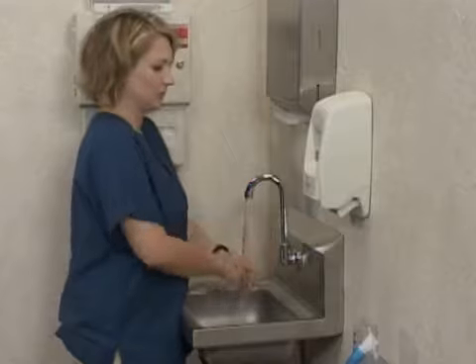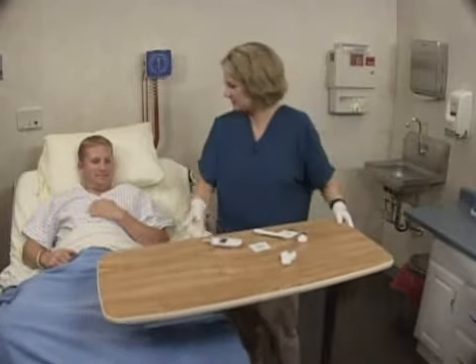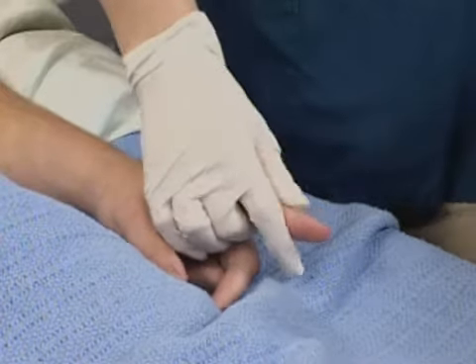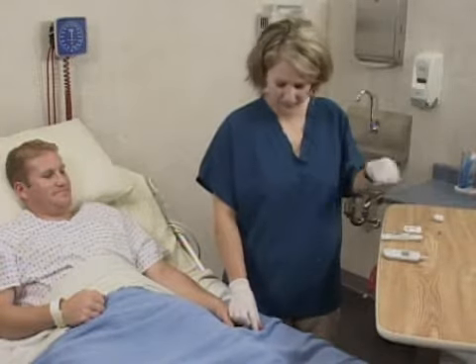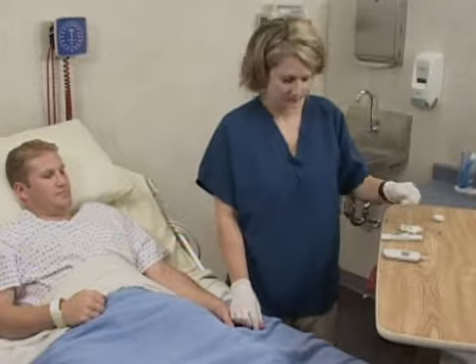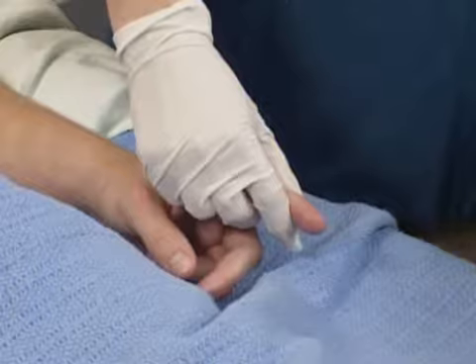The nurse washes her hands and puts on gloves. To prepare the selected fingertip, she places it in a dependent position and massages the finger gently toward the site to increase blood flow to the area. Next, she cleanses the site according to the institution's protocols and allows the site to dry completely. Alcohol, in particular, can affect the results if it has not fully dried.